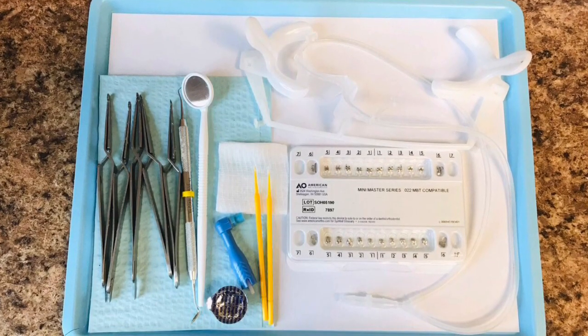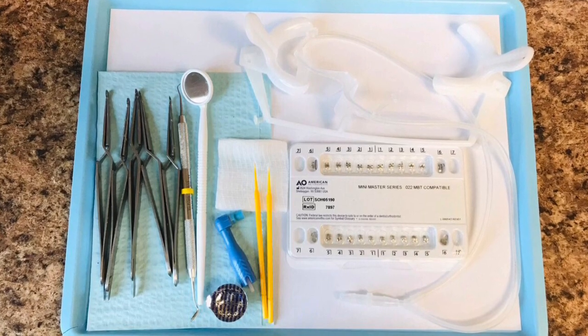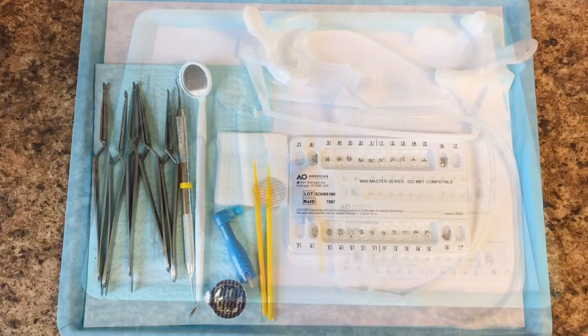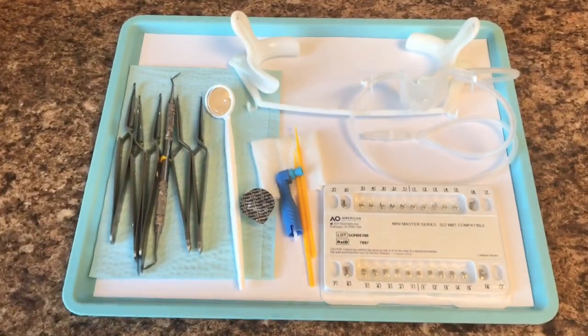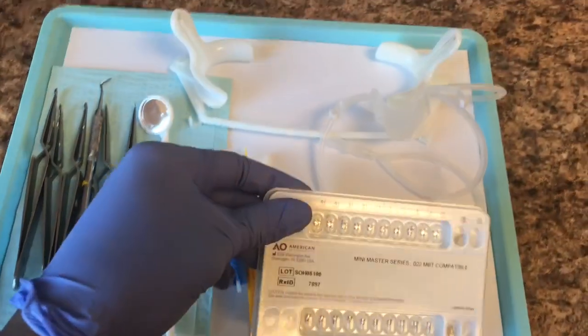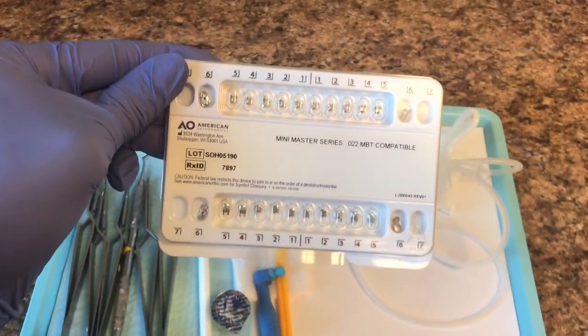So here's a bonding tray. Bonding means we're going to put braces on, and this is the tray that we'll use to put the braces on. Here we have your brackets, which are your braces — upper and lower.